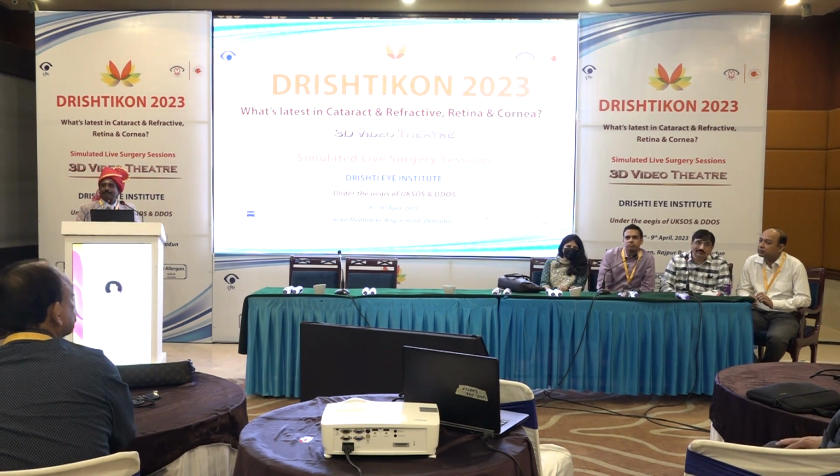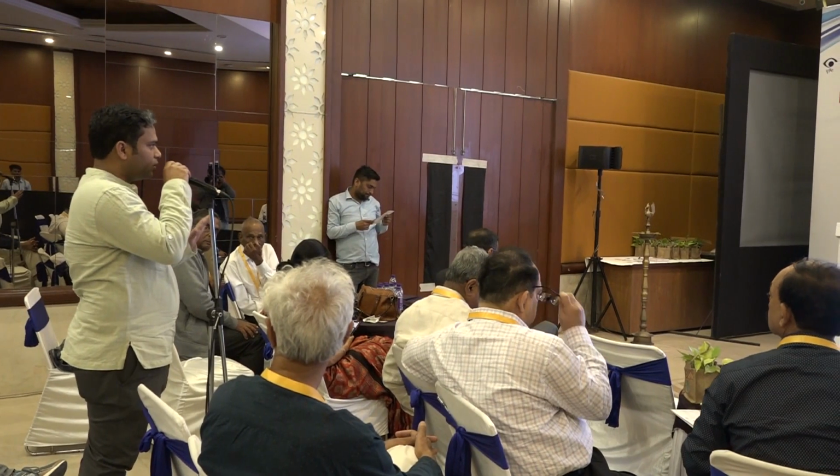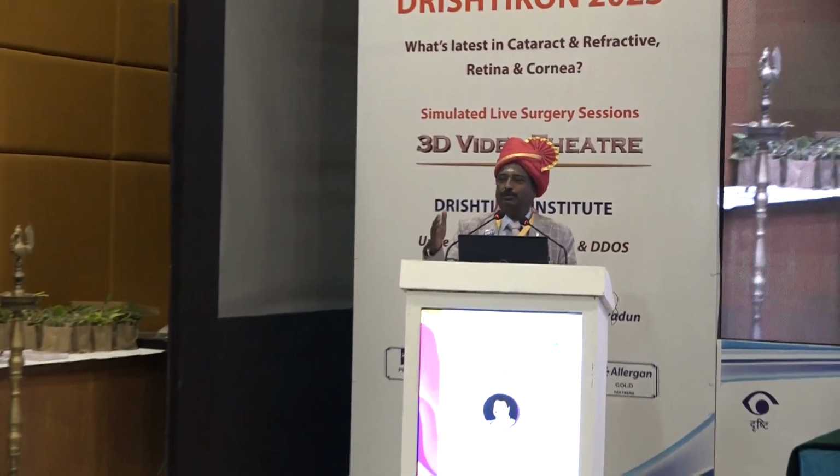Hello, sir. For long-standing retinal tractional detachments, like more than 1 or 2 years, we ensure that there are no iatrogenic breaks. But do you still make a retinotomy and drain the fluid, because that long-standing fluid will take a very long time to go on its own? So what I do is, if I clear all the traction, I use a PFCL to separate, put the fluid away from the macula, and use silicone oil as a tamponade. But there should be 100% no break, because if there's a break, it will not work. If no iatrogenic break has happened, then I don't make a retinotomy. But if a break happens, I use that for endodrainage and make sure I do a good laser and pan-retinal photocoagulation and complete the surgery.